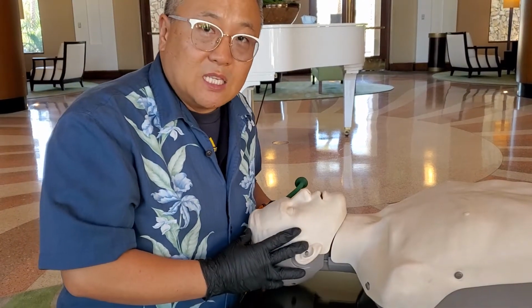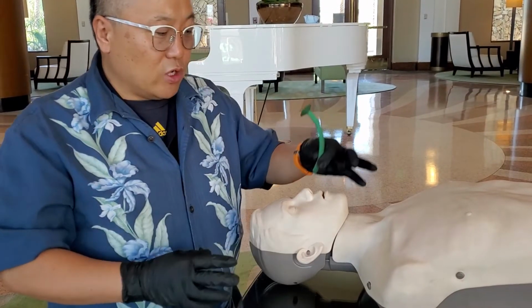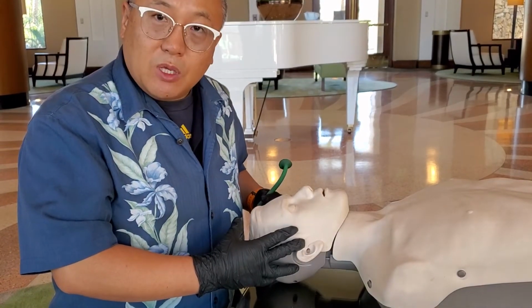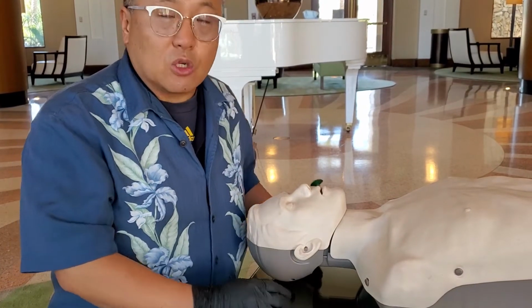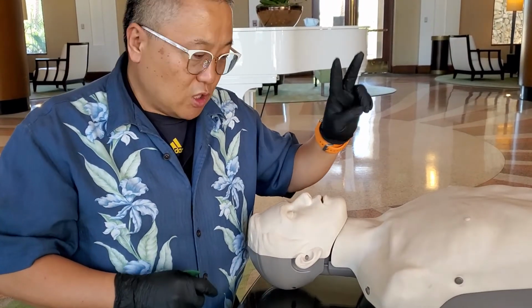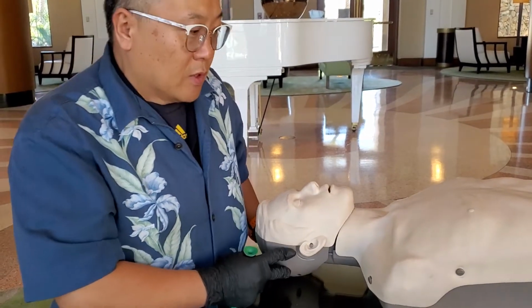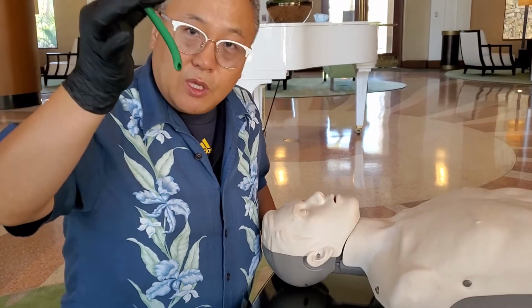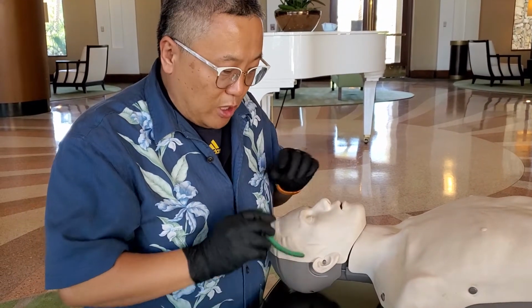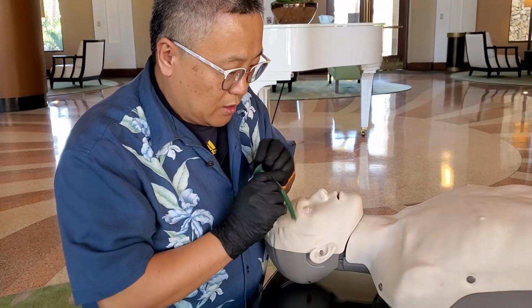You call it ICP, intracranial pressure. So we are increasing the ICP, intracranial pressure, so it can cause a lot of problems. So the contraindication is two things: no facial trauma and no head injury, okay? So when you use the NPA, it's the same thing. You measure from the earlobe to the tip of the nose, okay?